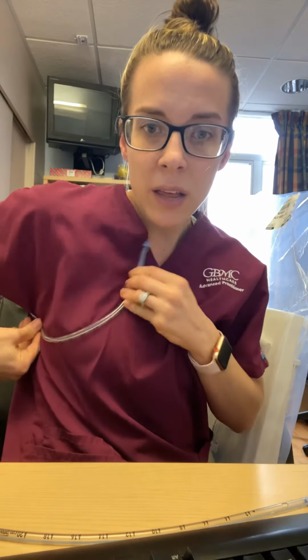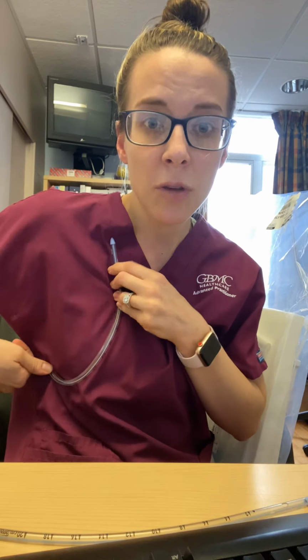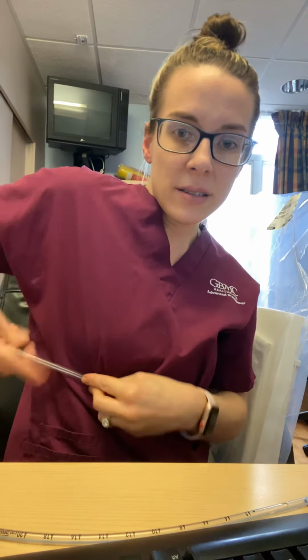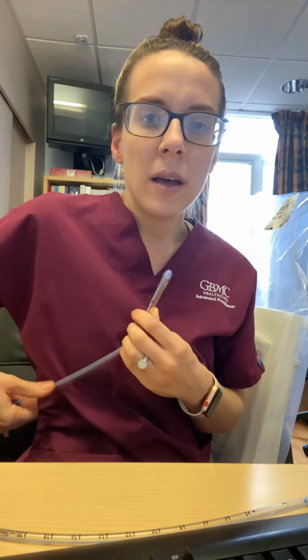Okay, when 2 tubes are inserted, one will be placed apically, like I was just showing you, because the air rises. So this is to drain any pneumothorax, which tends to be apical. And then one would be placed basilar to drain any fluid. I feel like most commonly patients here only have 1 chest tube, but if they had 2, that's typically the reason why. Next slide.